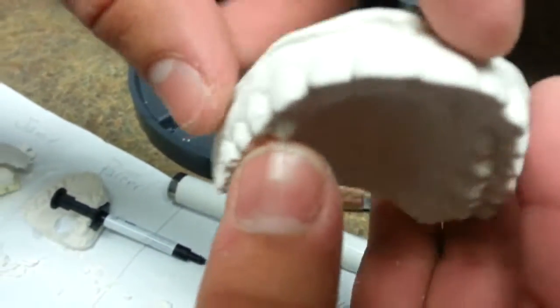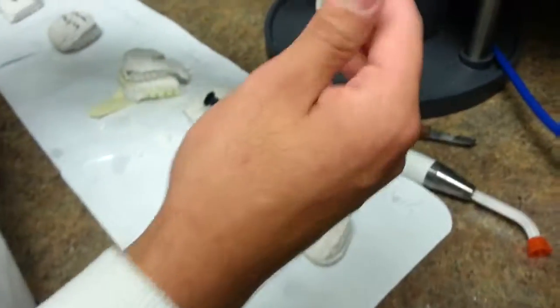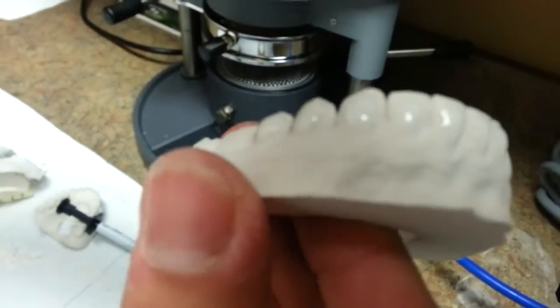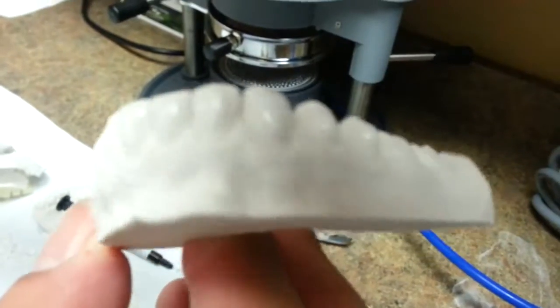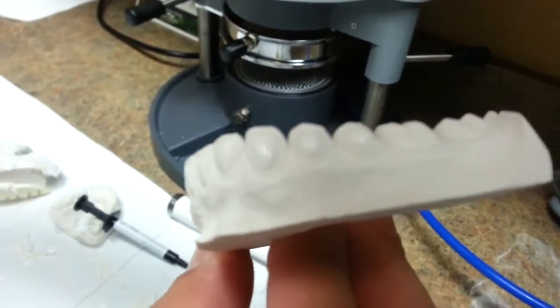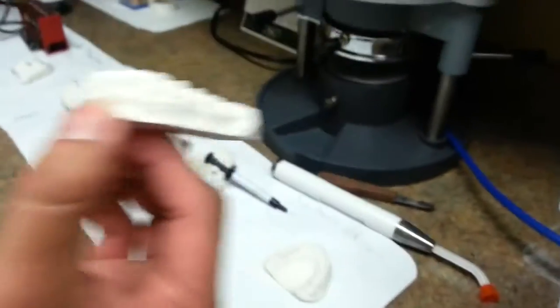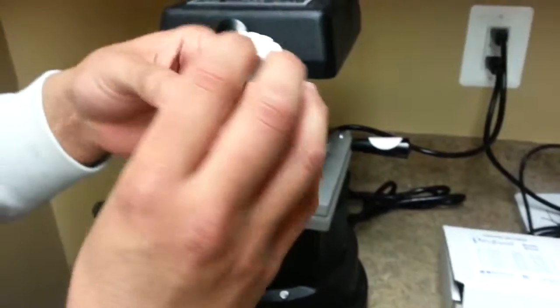Again, you're gonna go all the way around until the second premolar. Now, once I'm done, it's gonna look like this, like I already did at the bottom, from second premolar all the way down to the other second premolar. All right. So now, this impression is ready. I'm ready to make a bleaching tray with this.